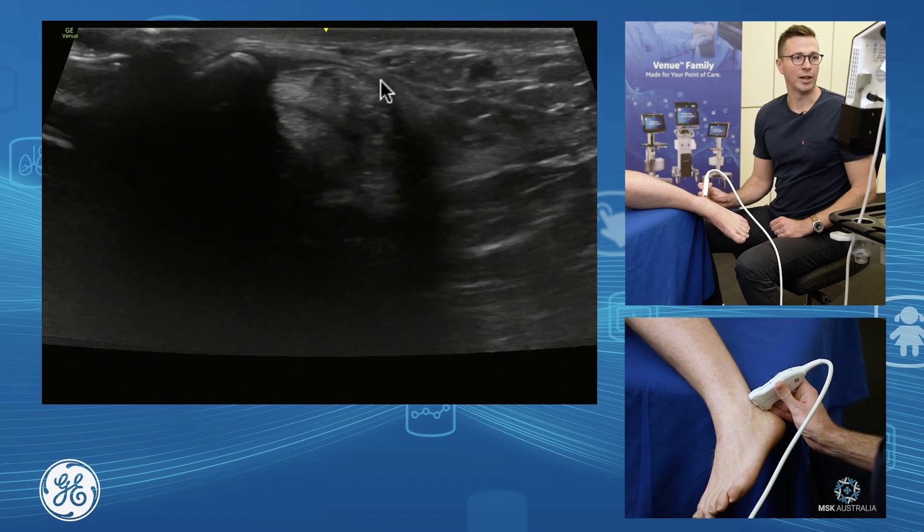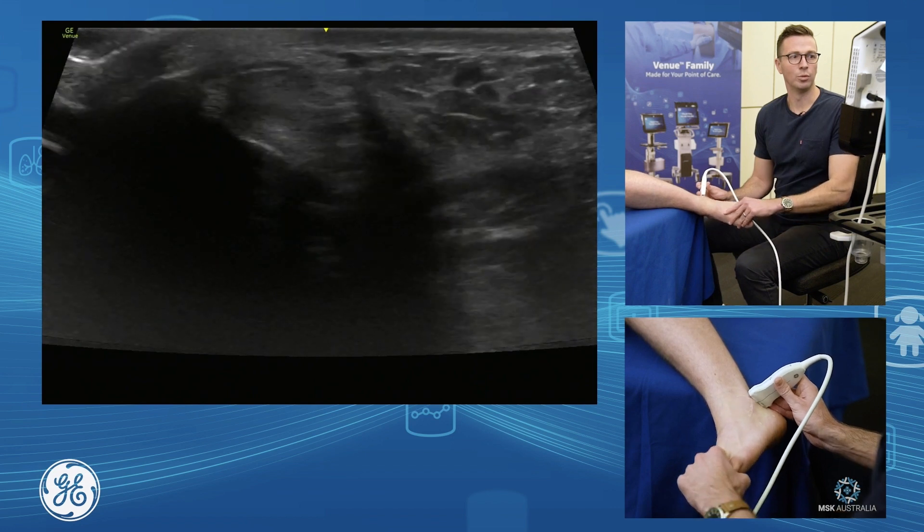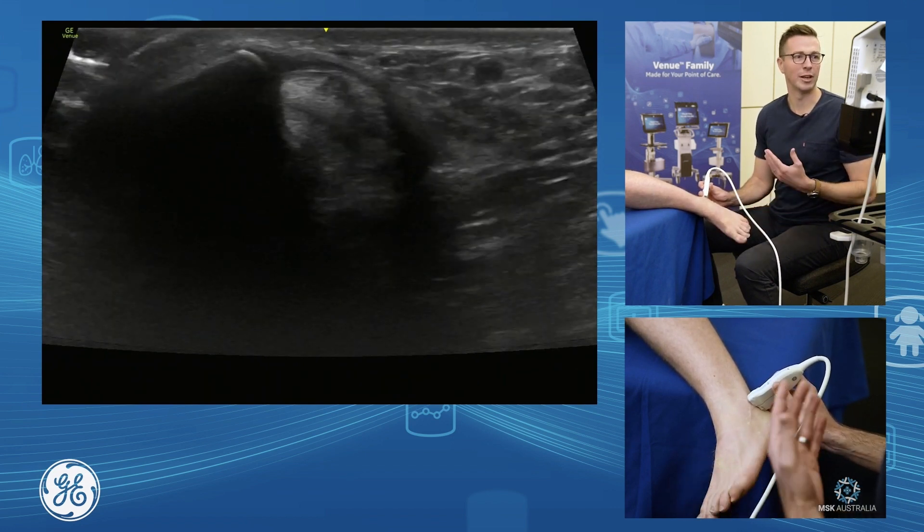We also have our peroneal retinaculum around the fibula that holds the tendons in place. If you have snapping or dislocating peroneals, this is where you would assess for it - with a circular movement and a bit of active eversion, which will often get them to snap and click.